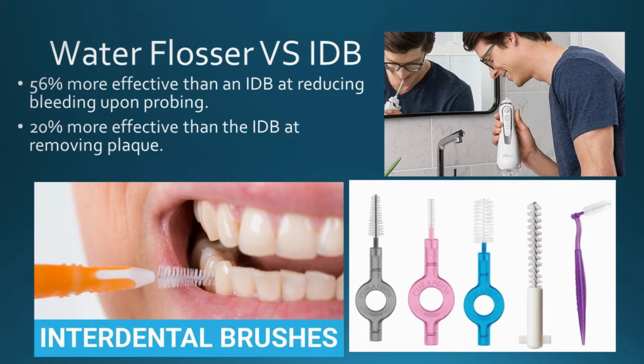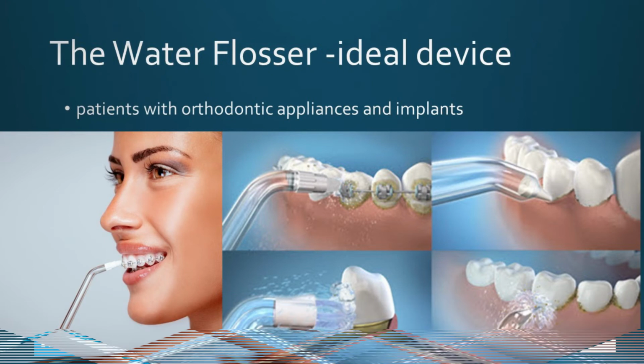The researchers have found, on comparing the interdental brush with the WATERFLOSSER, that the WATERFLOSSER has much more benefit. It reduces bleeding upon probing, being nearly 56% more effective than the interdental brush, and 20% more effective in plaque removal. So advise your patients to use a WATERFLOSSER rather than interdental brushes.